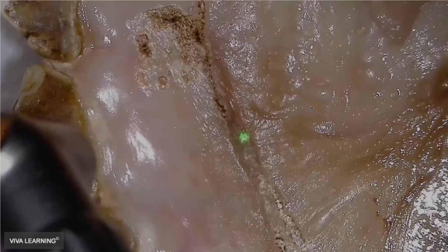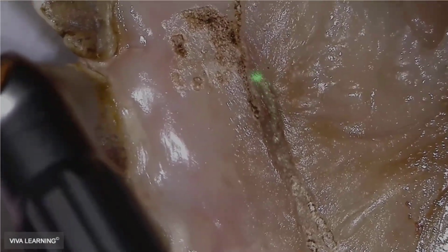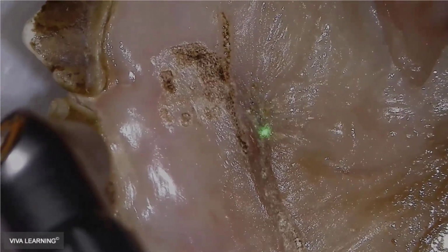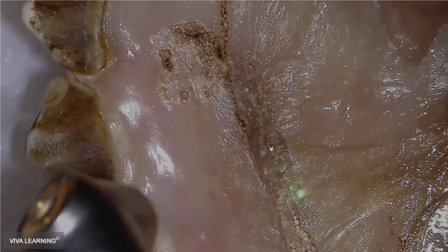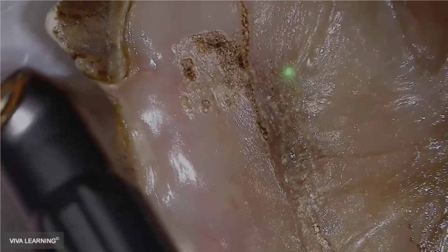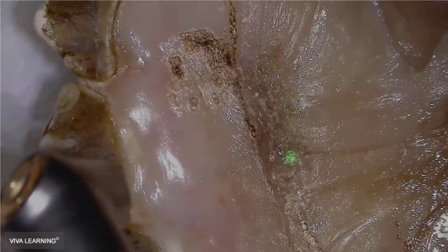It's because it's basically condensing down that collagen there. So here it is basically kind of moving along. You can see at positions even far away from the actual center point of that aiming beam that it's pulling collagen in, right? So pretty incredible effect from that.